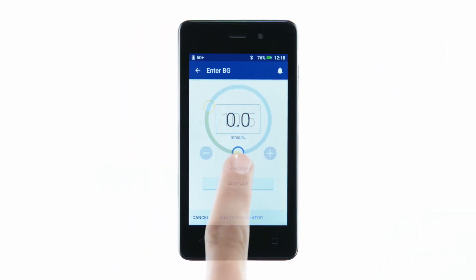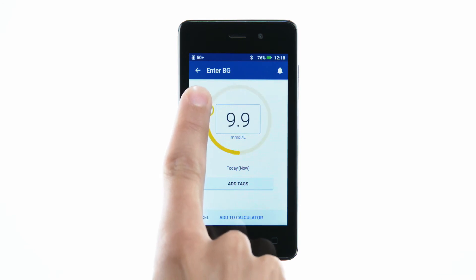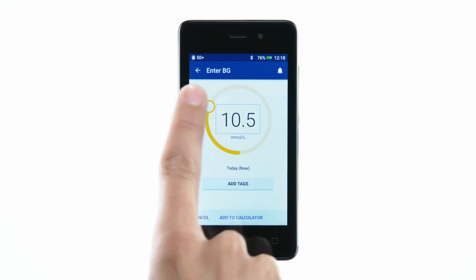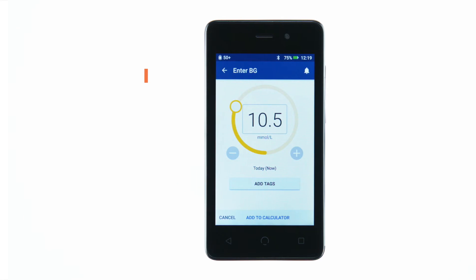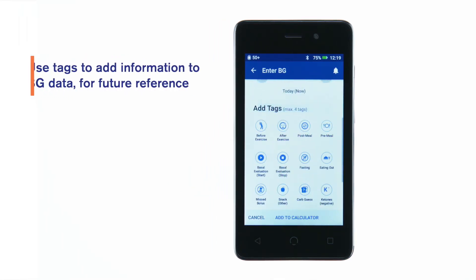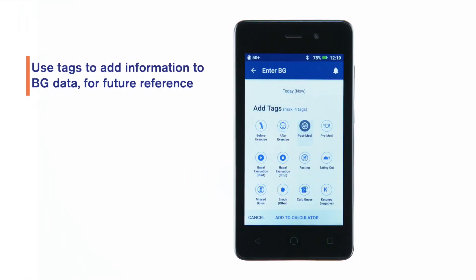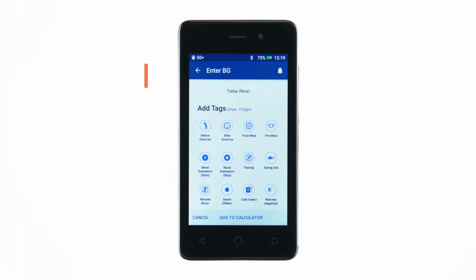You can also use the slide wheel along the circle to enter a BG reading. If you'd like to tag the BG reading, tap Add Tags and tap a tag. Tap again to deselect a tag. You can add up to four tags. Tap Add to Calculator.